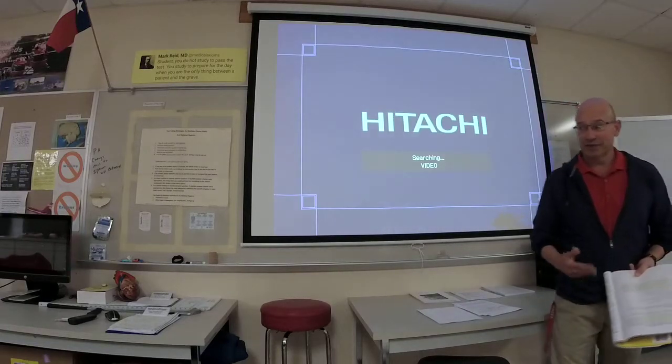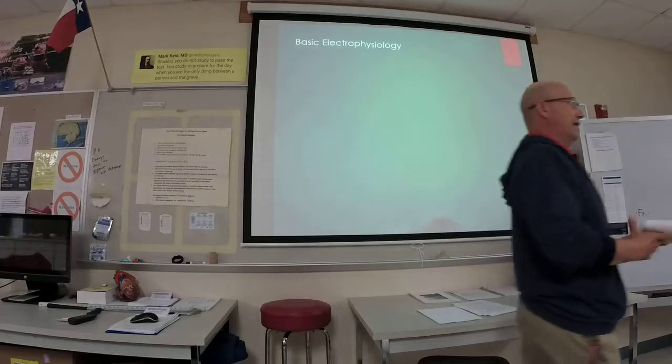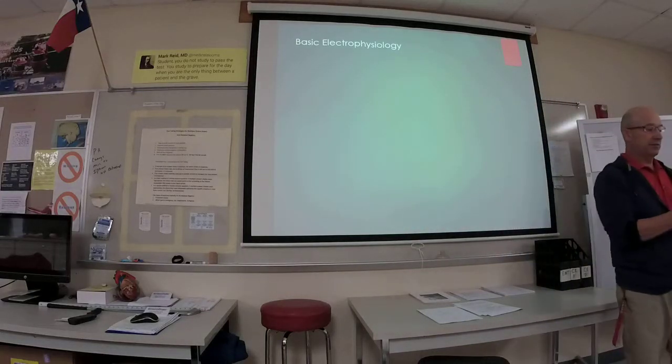Not that if patients come in, you're going to let them rest for 30 minutes before you do an EKG. You're going to anger them: for a 5-minute test, they have to rest for 30 minutes.